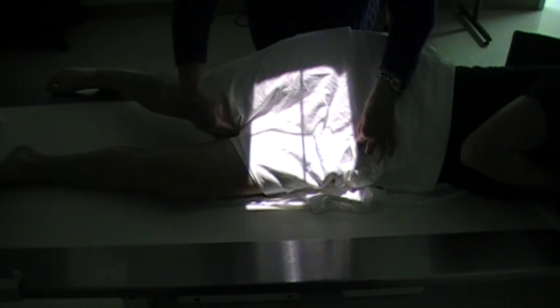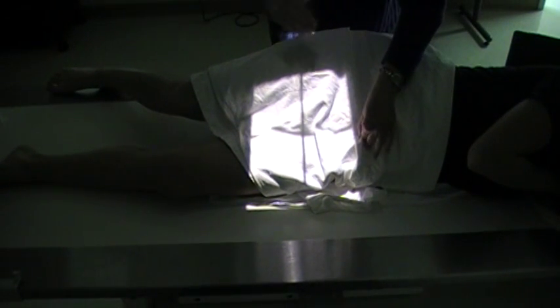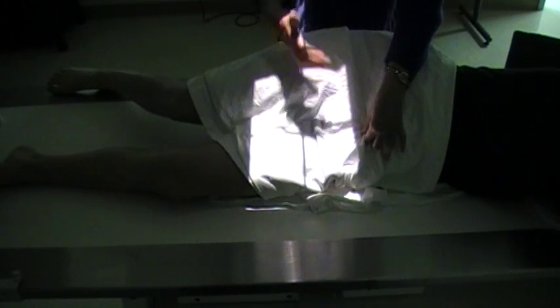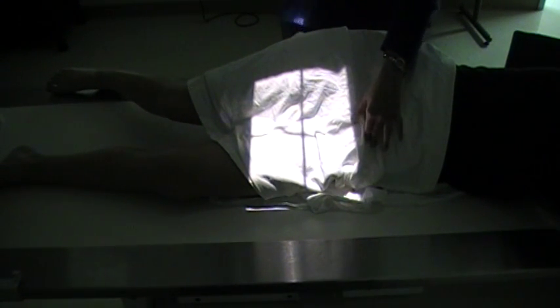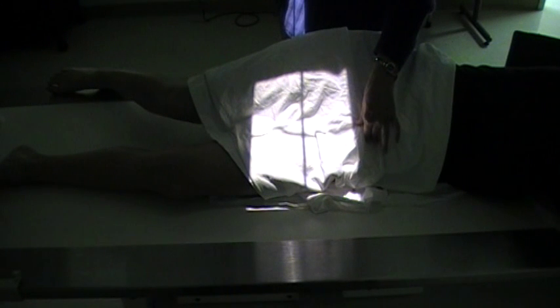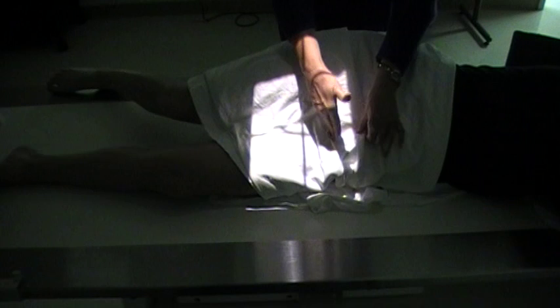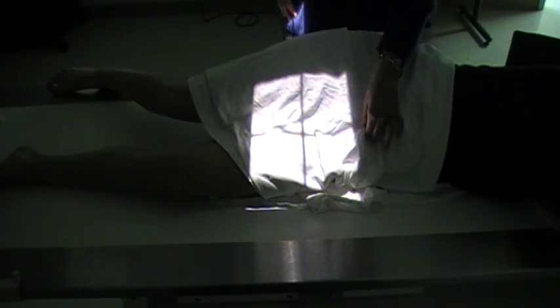Okay, and then here is the femur, so the longitudinal line of your light is going to be down the middle of the femur. Now you want to make sure that this upside hip is out of the way. If it's leaned forward too much, it's going to superimpose over the hip that's down, and that's what we're wanting to see better, the proximal femur with the hip joint. So we have our femur out of the way, and we'll be getting our proximal femur to include the hip joint on this lateral. Then next we'll do the distal portion of the femur.